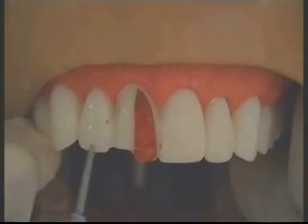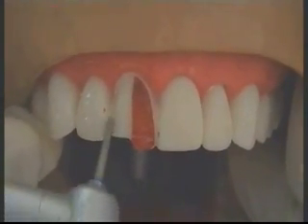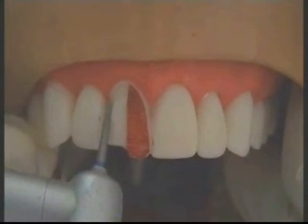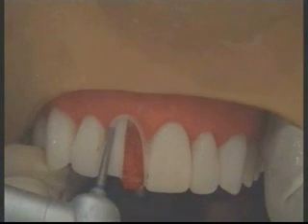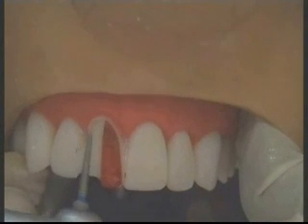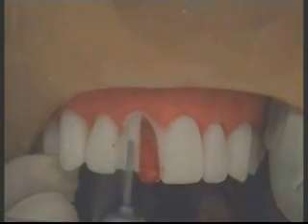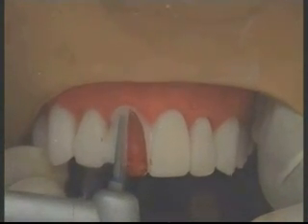Care is taken not to injure the adjacent tooth, just by leaving a thin lip of enamel adjacent to it during the proximal reduction.